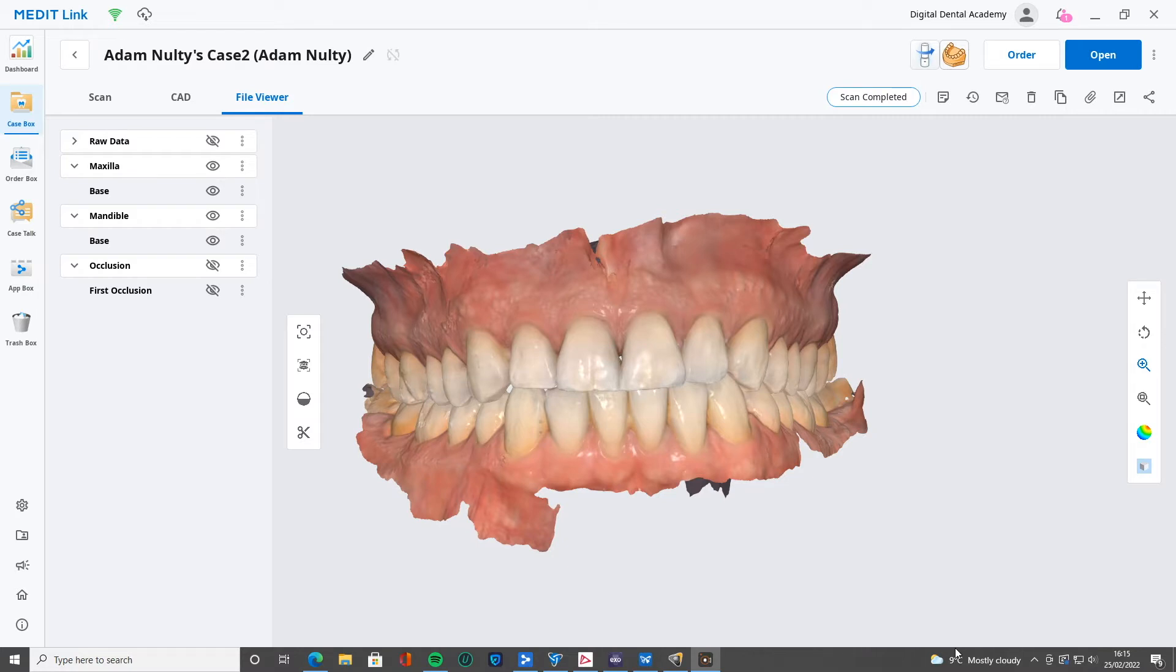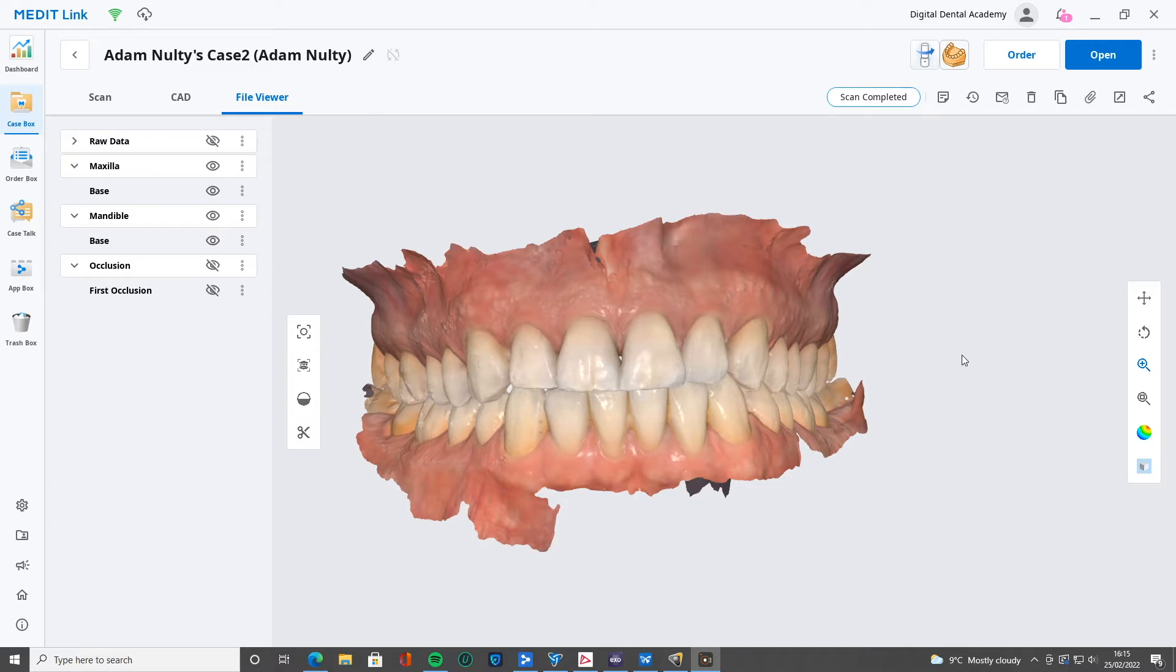I'm just going to run through it and you'll see exactly how easy it is. I'll show you a couple of tutorials about model making in MeditLink. You'll see over the next few weeks there'll be Exocad and also MeshMixer. But here we have the model, the scan open here in MeditLink.